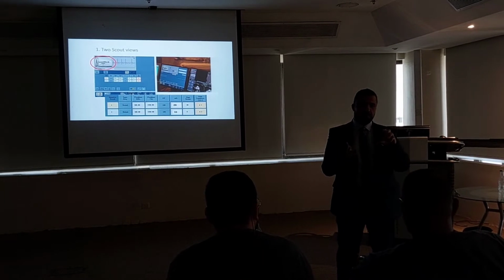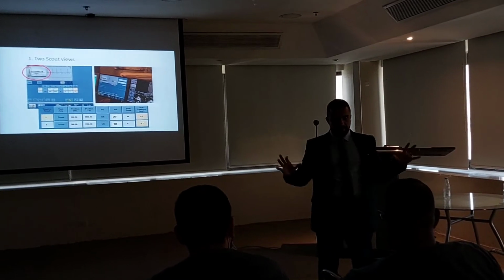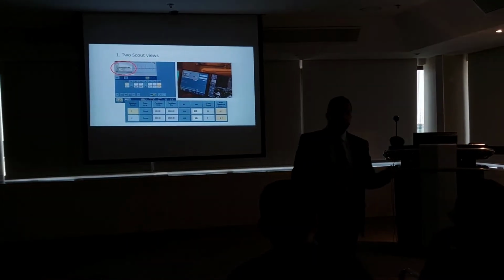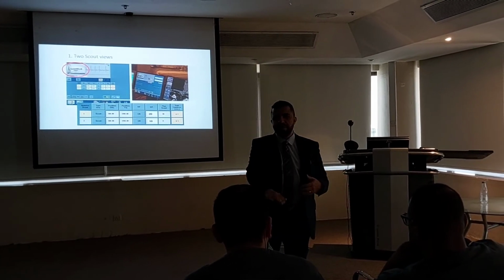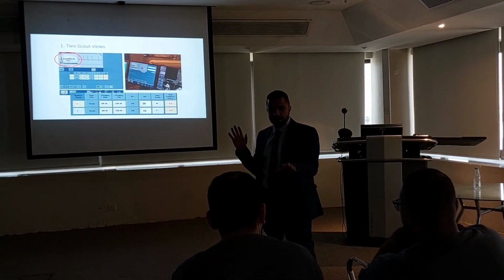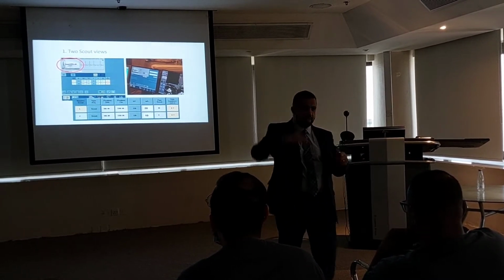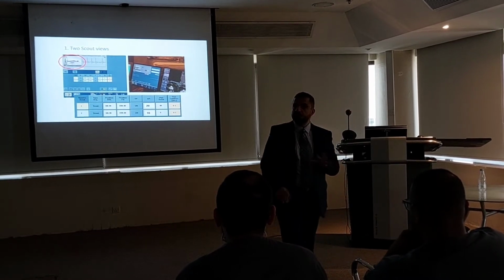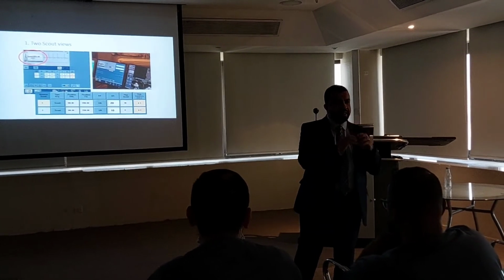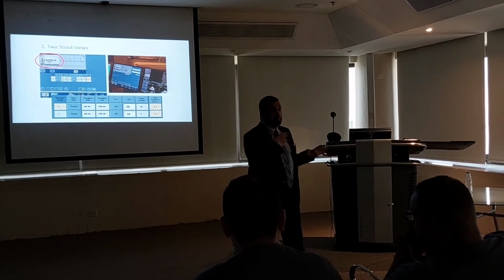This is now from the first practice, the manual. It's good that the technologist is monitoring everything, controlling everything. But the automatic one has fewer human errors. So I am instructing the patient, and then somebody calls me, and I'm not listening, or sometimes my voice is low, or I forget to increase the loudness of the voice. So many things can interfere. And on top of that, it's very good for the patient to hear the same voice, the same instructions every time. That's much better and clear. So, me personally, I prefer that.